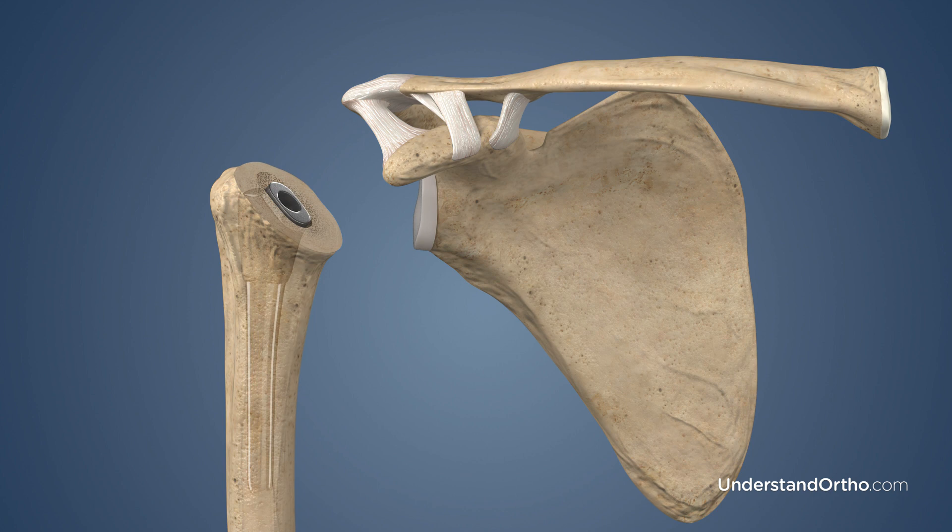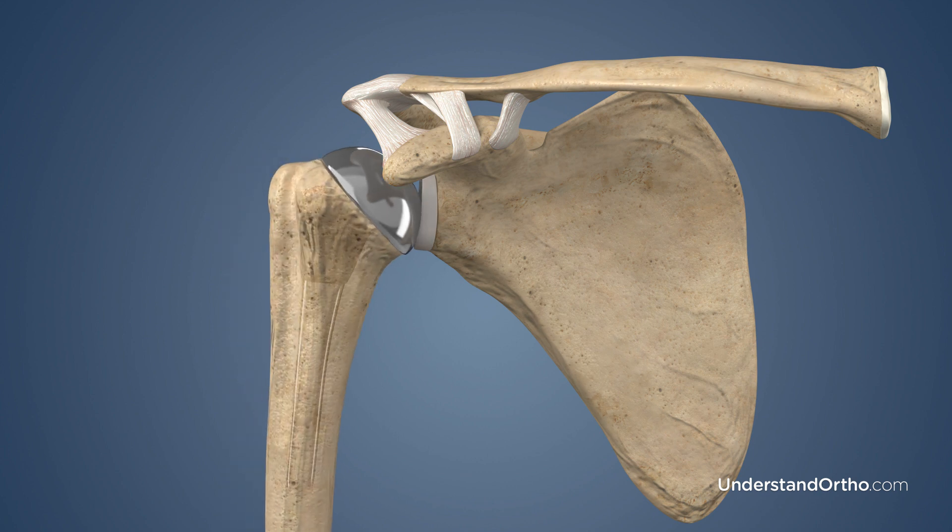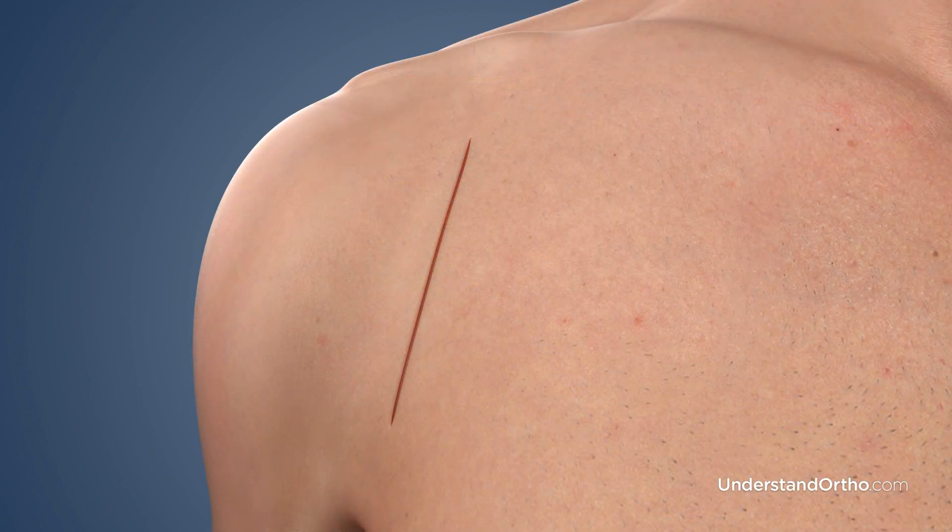The decision of whether to press-fit or use bone cement to secure the implants to the bone is made by your surgeon, depending on the quality of the bone. The ball portion of the implant is secured to the humeral stem. Finally, the bones and implants of the shoulder joint are placed back into the proper position, and the incision will be closed with sutures or surgical staples.